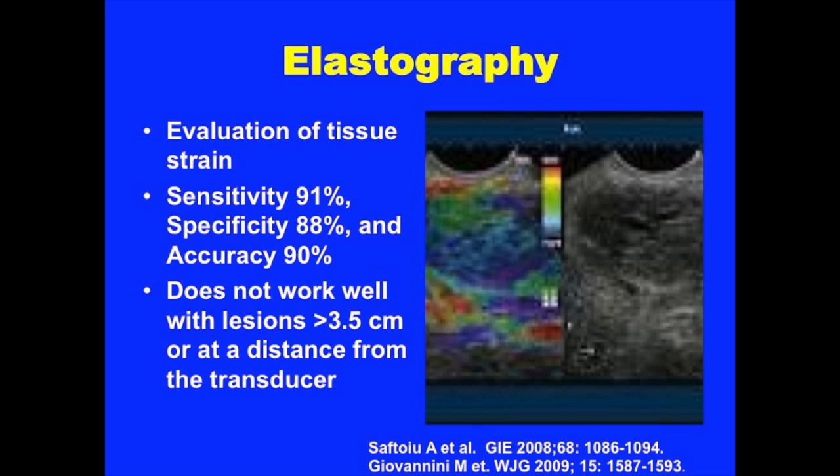The problem with elastography is it does not work well with lesions that are large, greater than 3.5 centimeters, or if they are at a distance from the transducer. So helpful information, but not there yet.